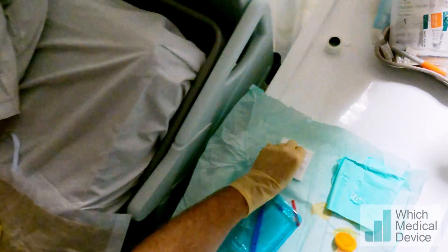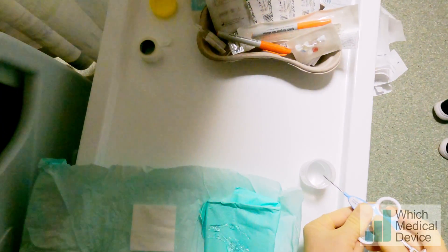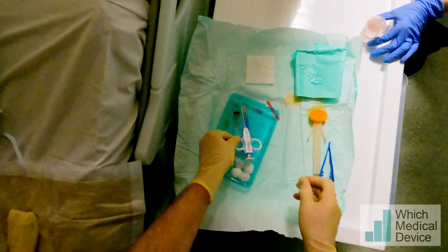Okay, that's it done. Awesome. Let's just check we've got a good sample — if we haven't, we'll need to do that again, I'm afraid. Oh, that looks like a good sample. I'm happy with that. I'm just going to fire that and leave that there.